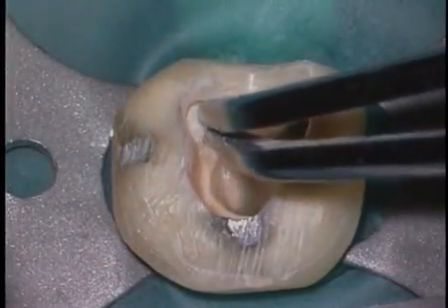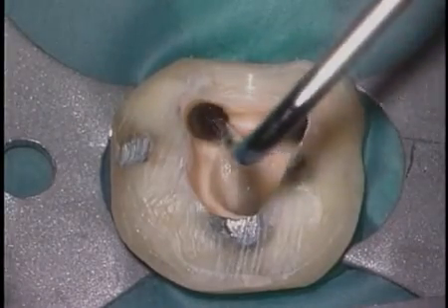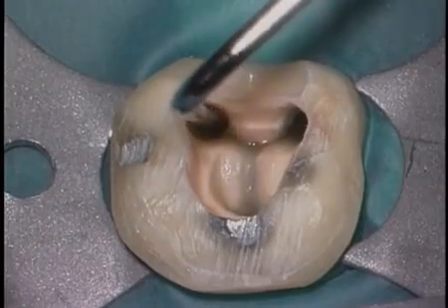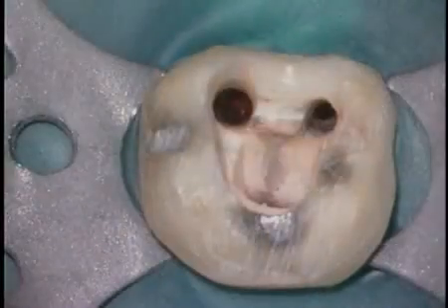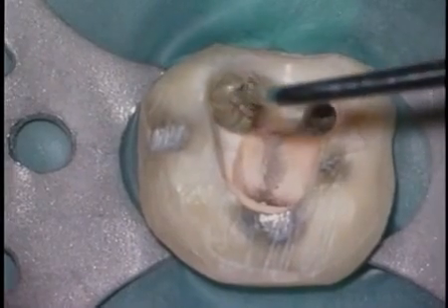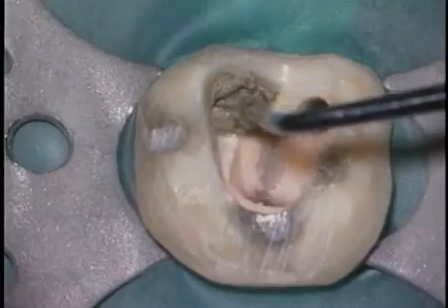And additionally, shaped canals can receive colocoat to hold their positions, so we won't become blocked inadvertently during the placement of the restoration. You can now begin to look towards repairing the perforation. Blot out the surplus blood and mop it out with a series of paper points. Drying the canal completely is probably not realistic, but fortunately MTA is not jeopardized by a moist field.